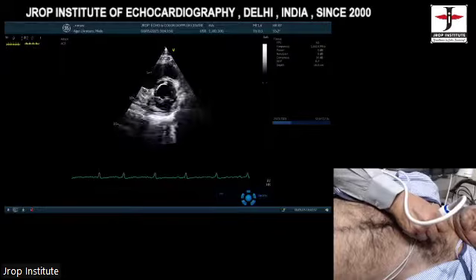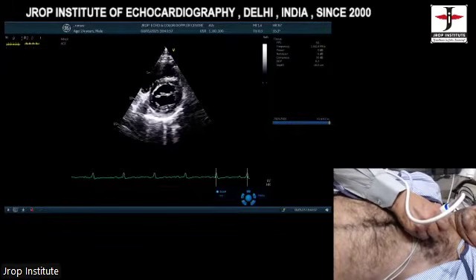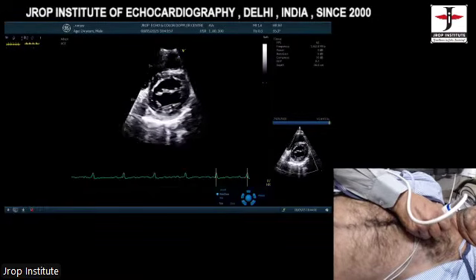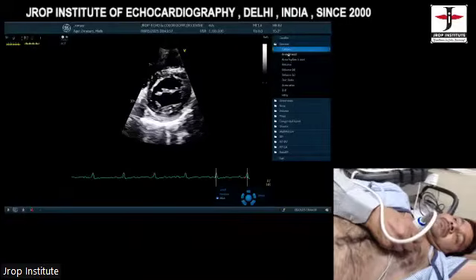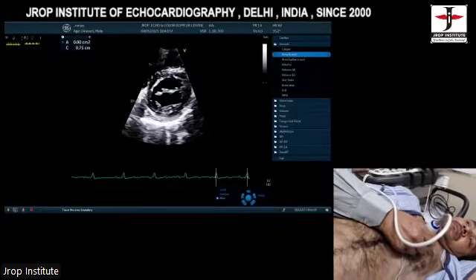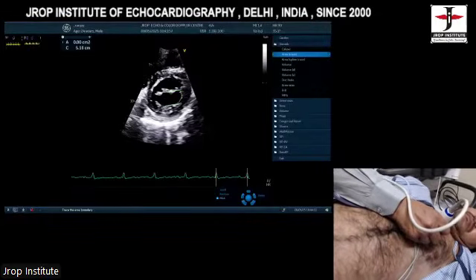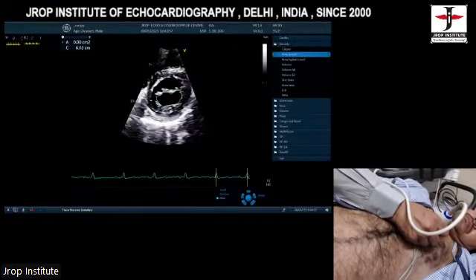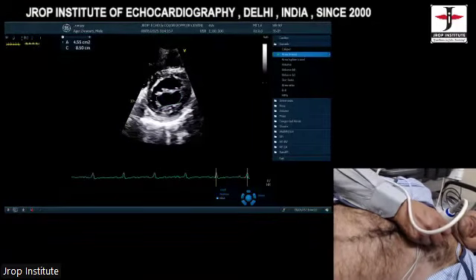And wherever you start seeing the mitral valve, that is the mitral valve area in 2 dimensions. So now you can see a zoom view of the 2 dimensional area. This is the area, and this is the zoom view. We just trace from inner border to inner border. It's almost 4.5 centimeters square.